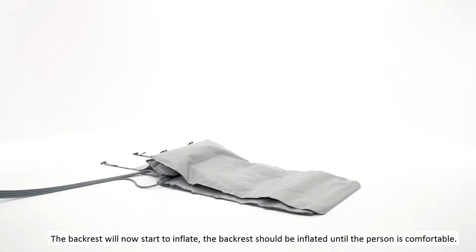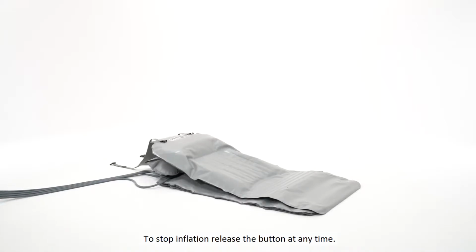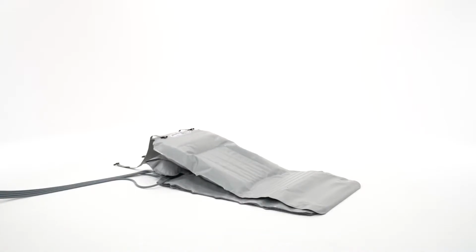The backrest will now start to inflate. The backrest should be inflated until the person is comfortable. To stop inflation, release the button at any time.